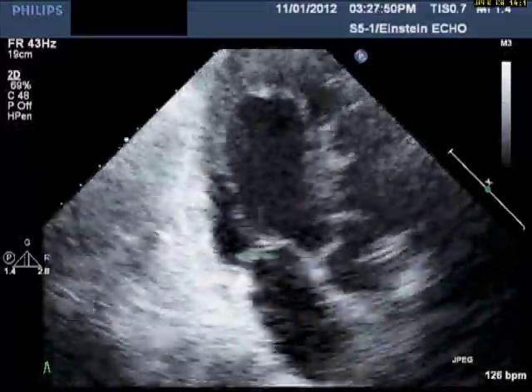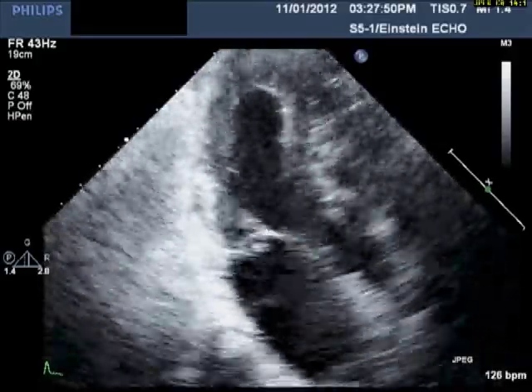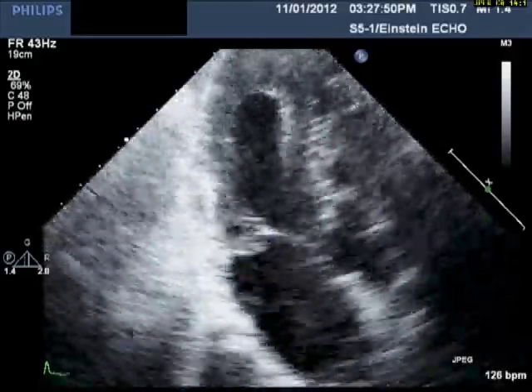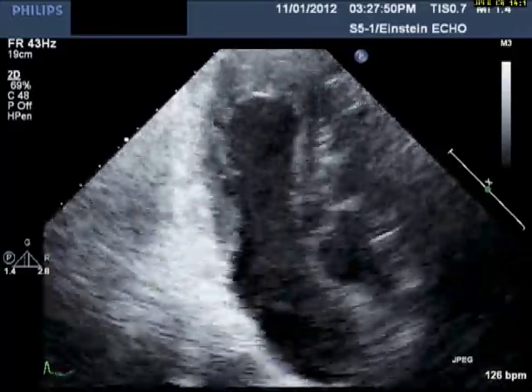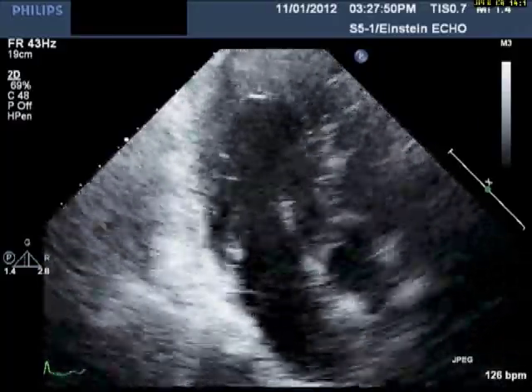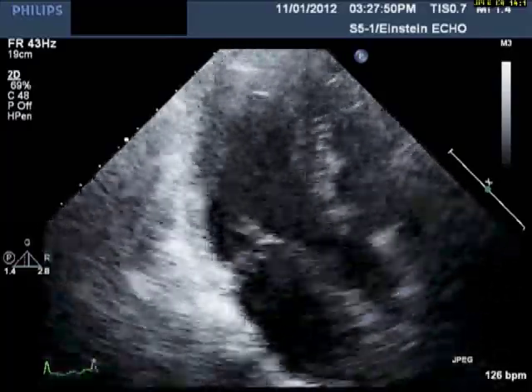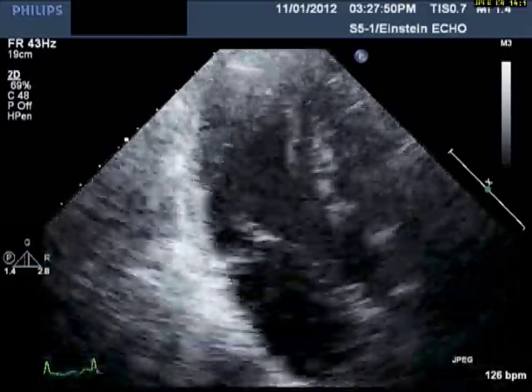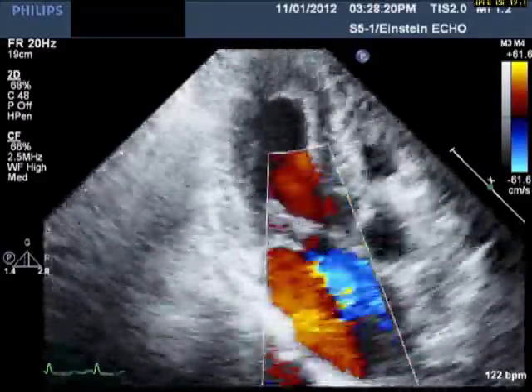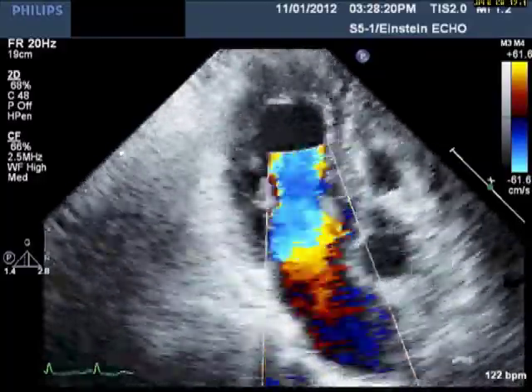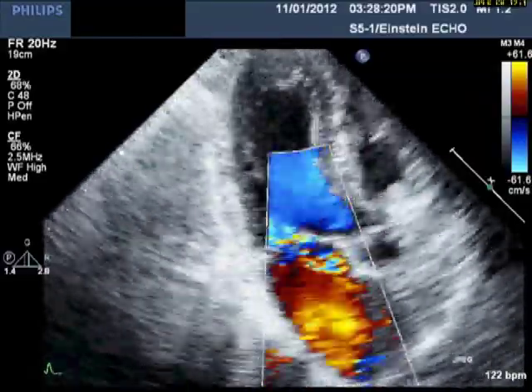The flail can also be appreciated in the following two images. First in 2D, this is an apical long axis image — you can see the flail posterior leaflet. And in the next slide with color placed on top, there is a very severe eccentric mitral regurgitation jet.